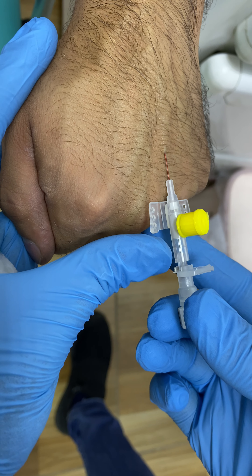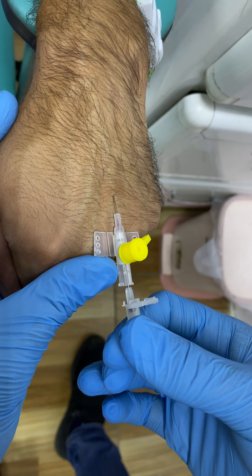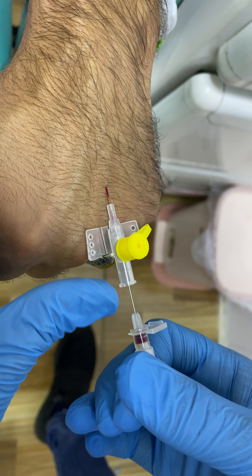Your mouth is hard to put in. Just bite thoroughly — you can put it in the middle.